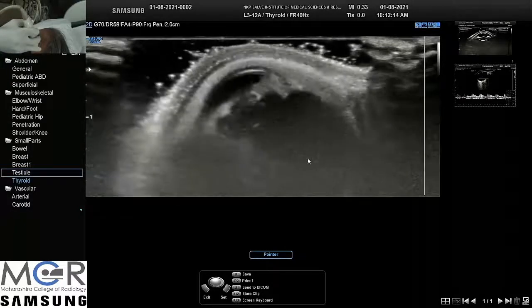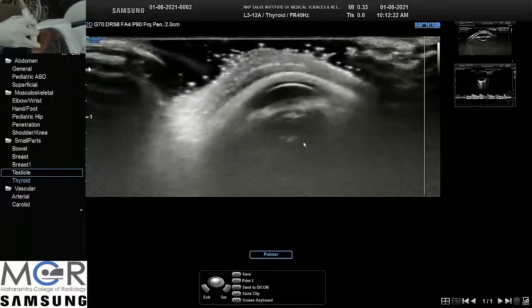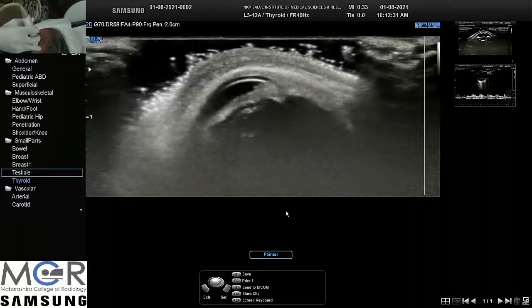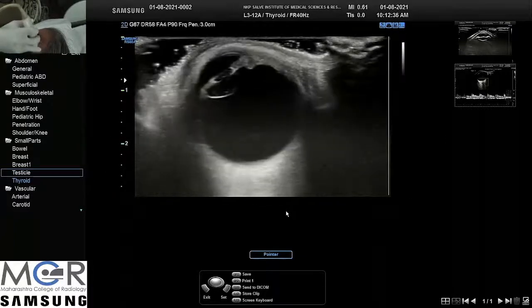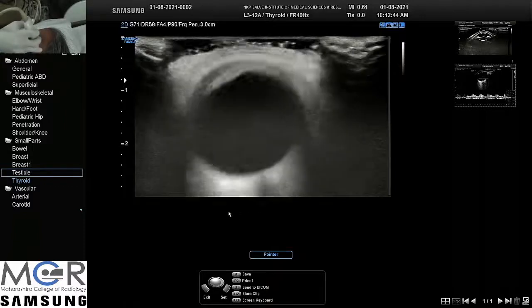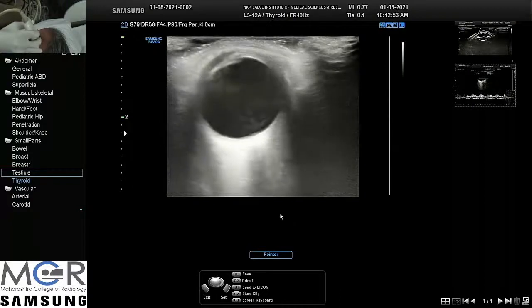You will ask me why you do B-scan here. This can all be seen with the ophthalmoscope or a regular eye examination. Yes, but certain things, the ciliary body thickening, the iris thickening, sometimes are not very well evaluated. And as this patient has got a cataract, they are not able to see what is happening in the posterior chamber or the posterior vitreous. So they need to know whether this anterior uveitis is limited to the anterior segment or there is pan uveitis, that means anterior and posterior uveitis together. For that, they send the patient to us, and our role is to see what is happening posteriorly.